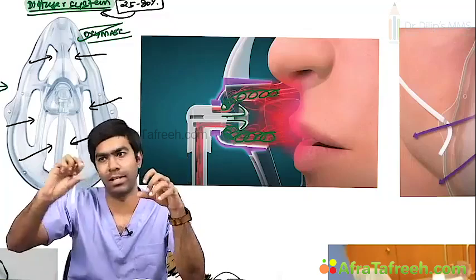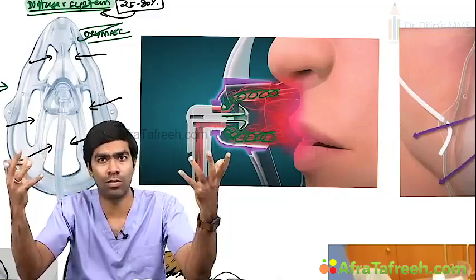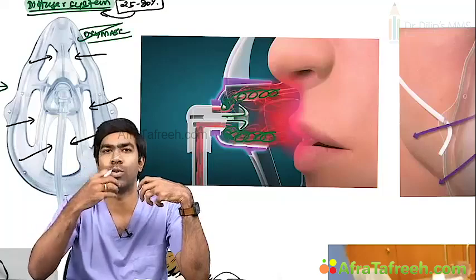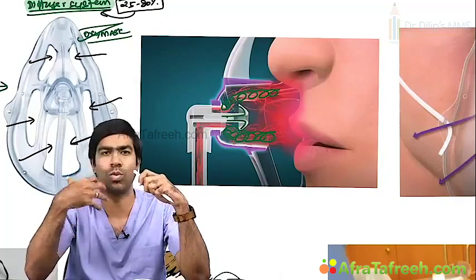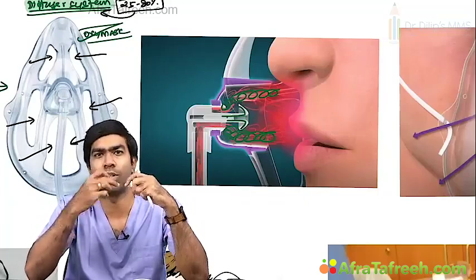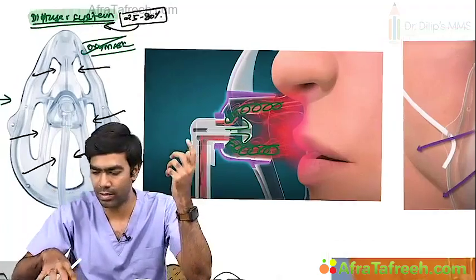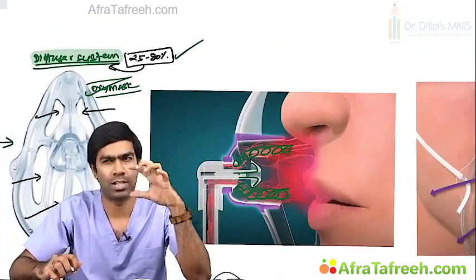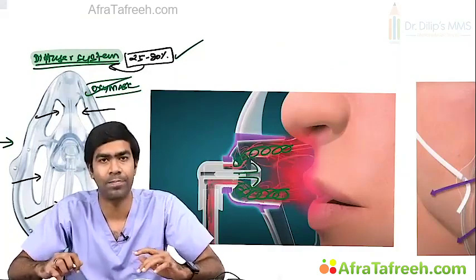That's a special patented system that creates vortices, rolls of gas, directed towards the nose and the mouth, which means instead of the gas being present throughout the mask, this pushes the oxygen directly into the mouth and the nose specifically. That's the reason why it is able to produce 25 to 80% FiO2. It's a very simple principle, that's all. But still, it's a patented thing that the Oxymask company devised.